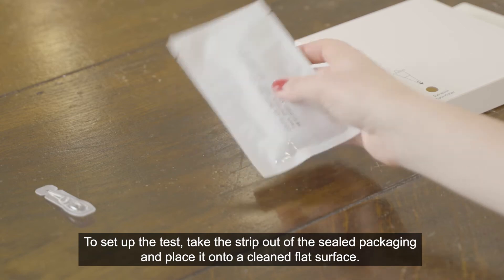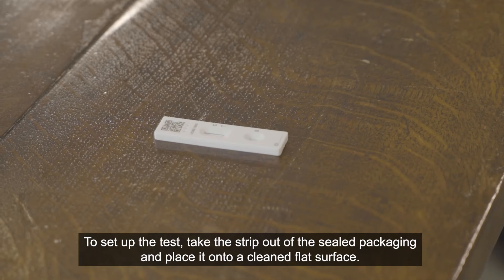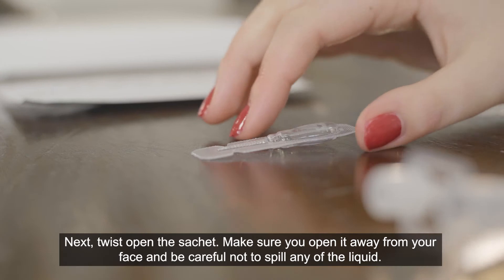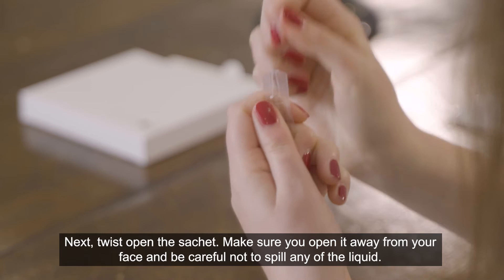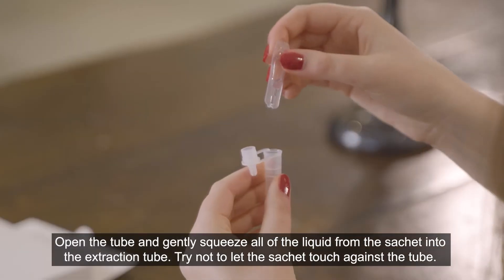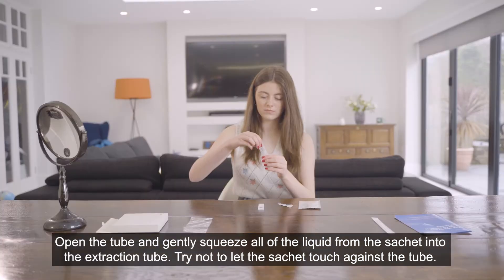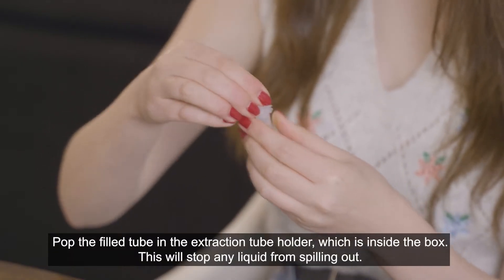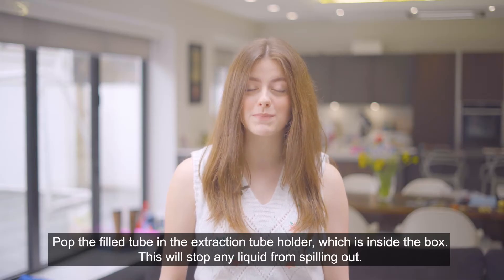To set up the test, take the strip out of the sealed packaging and place it onto a cleaned flat surface. Once you've opened it, start the test within 30 minutes. Next, twist to open the sachet. Make sure you open it away from your face and be careful not to spill any of the liquid. Open the tube and gently squeeze all of the liquid from the sachet into the extraction tube. Try not to let the sachet touch against the tube. Pop the filled tube in the extraction tube holder, which is inside the box. This will stop any liquid from spilling out.